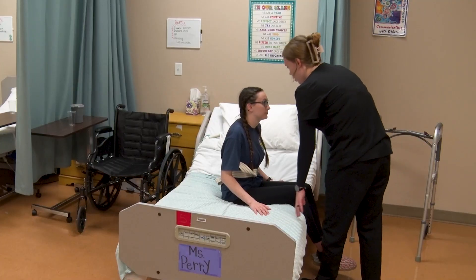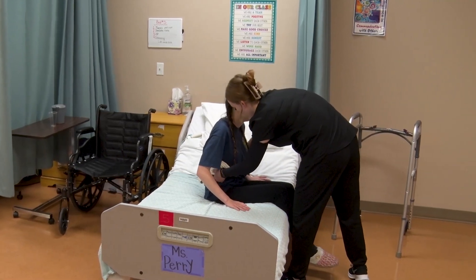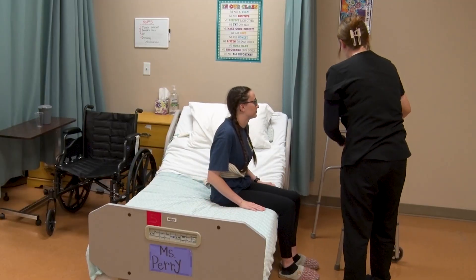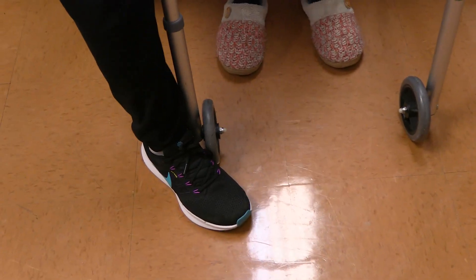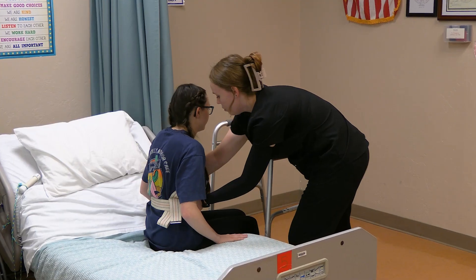On the count of three, can you please use your arms to push yourself forward and I will help you too. One, two, three. I'm going to put my foot in front of the walker so it does not slide out. On the count of three, please push up from the bed with your arms and then reach for these two handles. One, two, three.